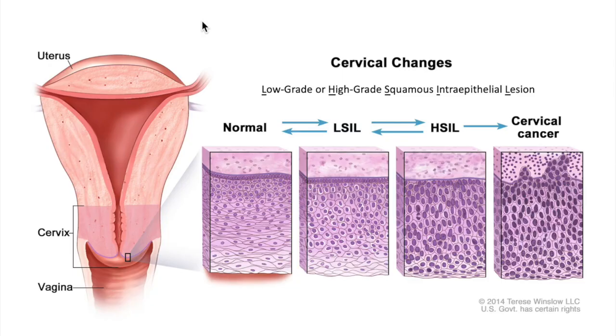So the PAP smear is a routine diagnostic test to determine if a woman is at risk of having cervical cancer or has cervical cancer. By swabbing the tissue and viewing it under a microscope, pathologists can see whether the cells are normal in terms of their shape of their nuclei and their cell edges, or whether or not they're cancerous. But pathologists can also see whether the cells are not completely normal but not yet concerning regarding cancer, or if they have progressed to a stage suggesting that they are at high risk of getting cancer.